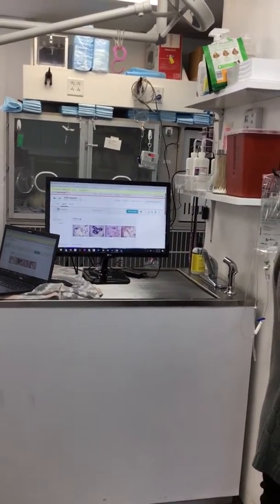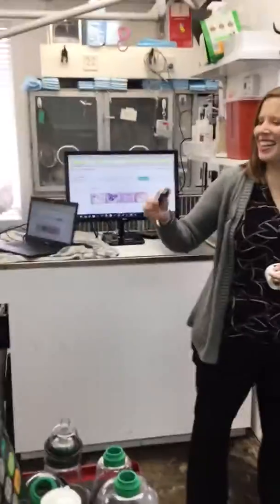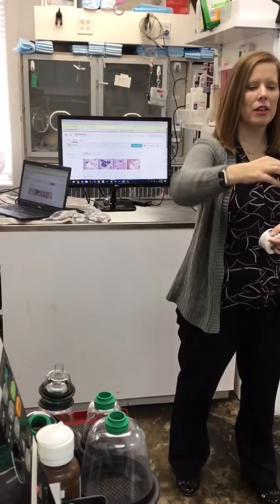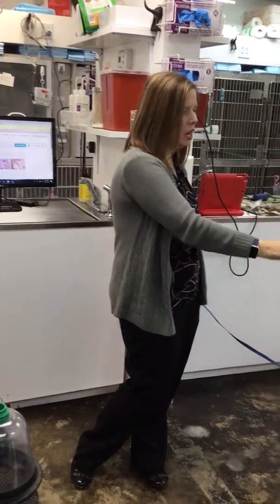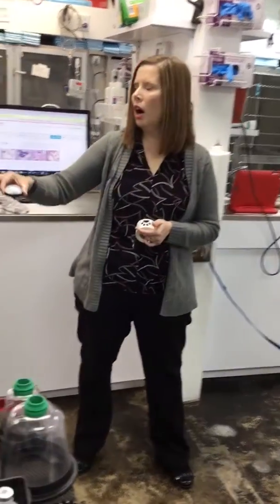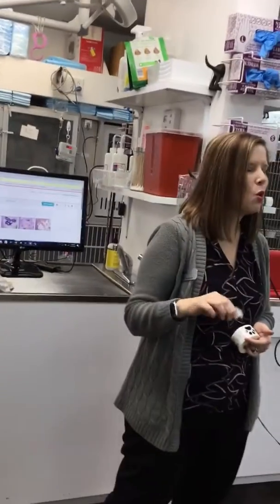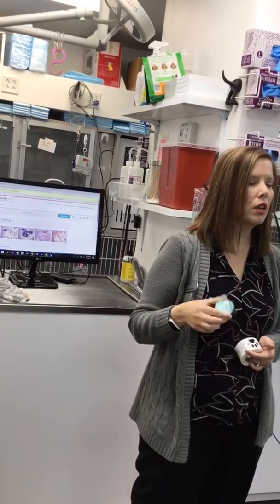So, I watched the videos online. Have y'all seen a snow globe before? Apparently Dr. Groman has not. So you know how when you do a snow globe, especially ones with real pretty white flakes, look how fast that settles. Imagine that as your struvite crystals. Now that's the best example, but other cells are heavy too. So if you don't mix it right before you get it, you're not going to get a good representation of your sample. How many times should you invert it though?